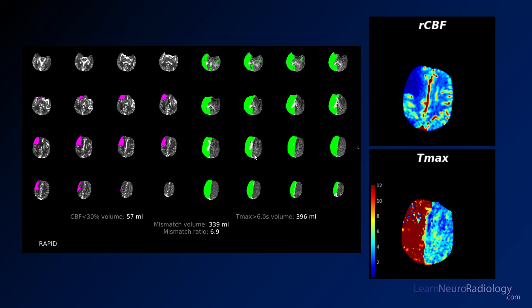Here are my results from CT perfusion — I have the rapid processing here. You can see that it's identified an area where the cerebral blood flow is less than 30%, an area of about 57 milliliters.